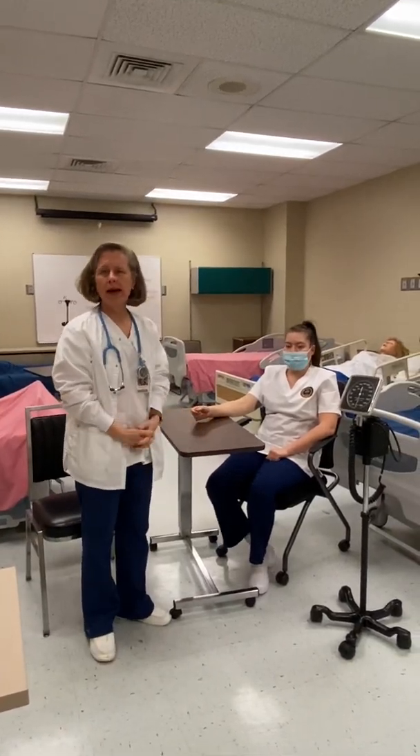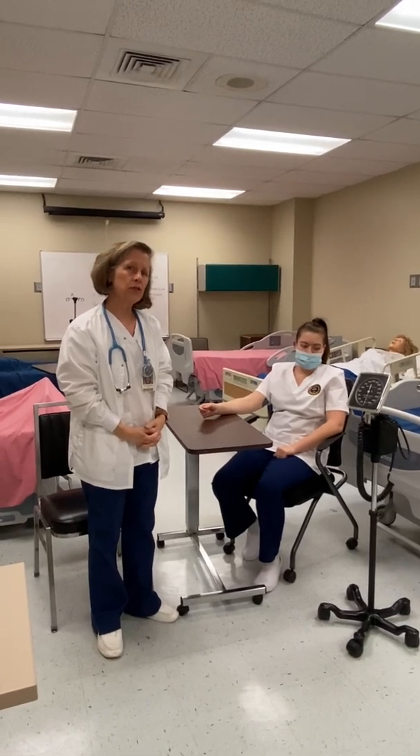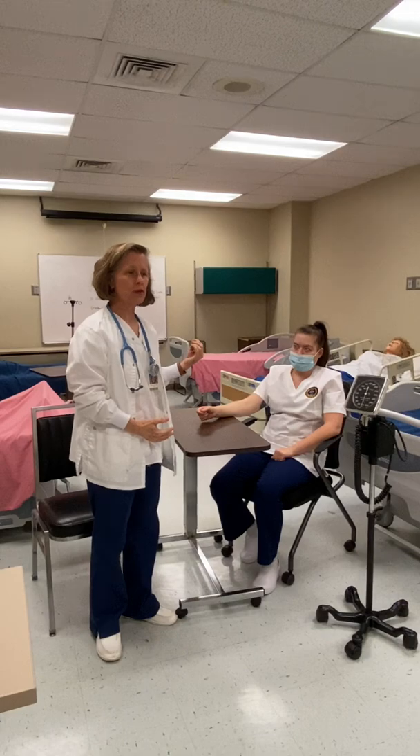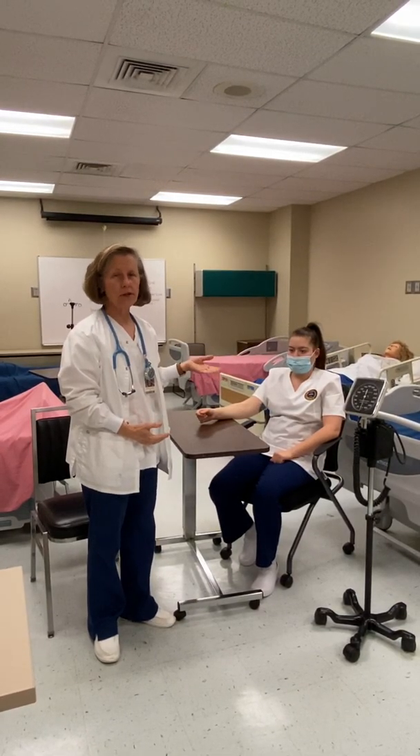Today we're going to be talking about how to do a two-step blood pressure. The way we do a two-step blood pressure is we're doing it twice, but we're doing it so that we prevent trauma by pumping up the blood pressure cuff too tightly.